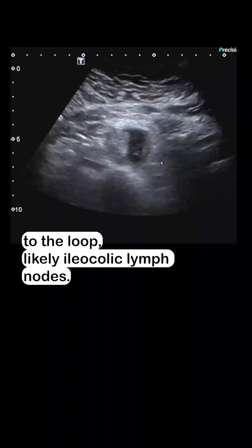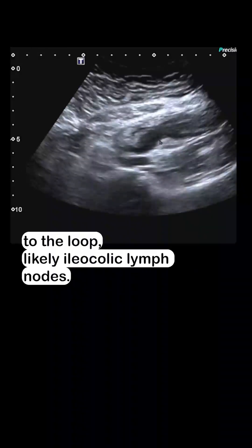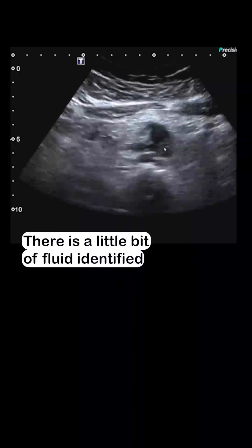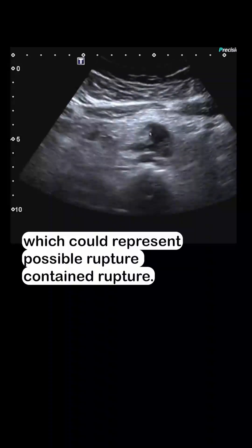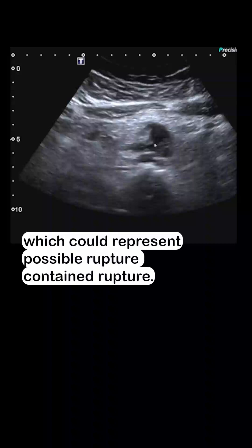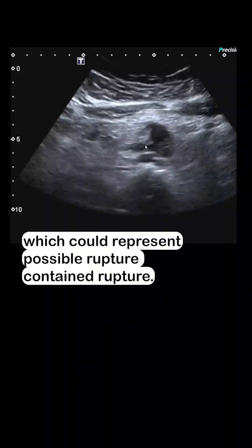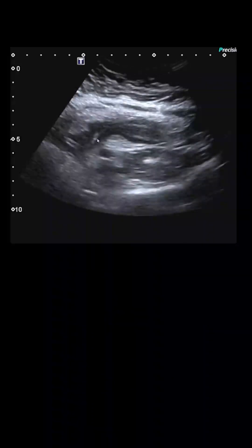Around the bowel loop there is a little bit of fluid identified, which could represent a possible contained rupture.